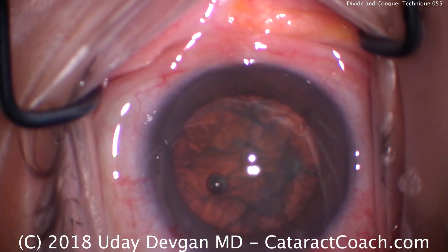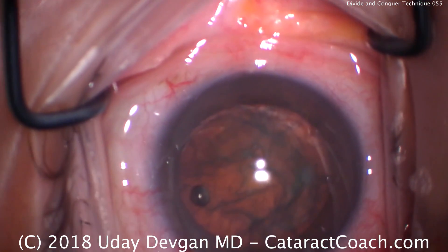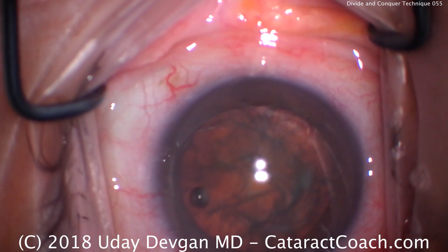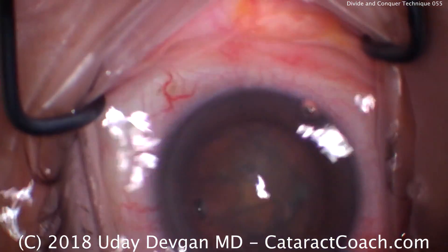Recoat the corneal endothelium with more viscoelastic — this is a dispersive viscoelastic. A little bit of patient movement here, so taking our time to calm the patient down, maybe give a little more IV sedation. Now ready for the phaco probe.